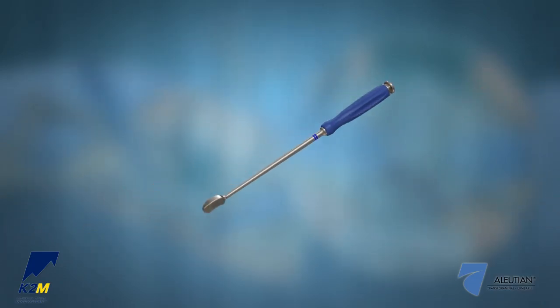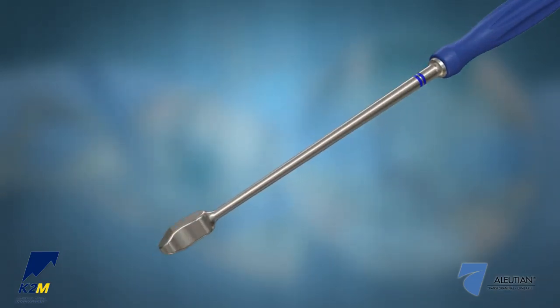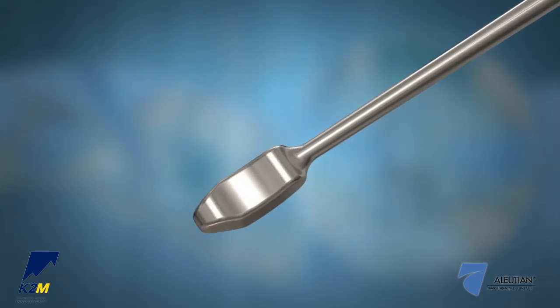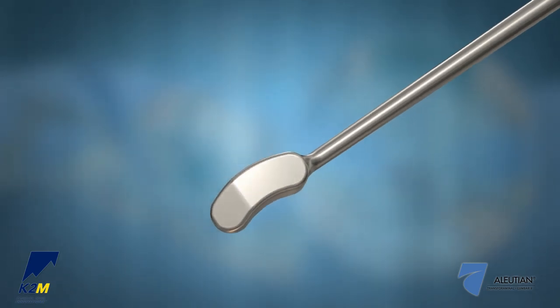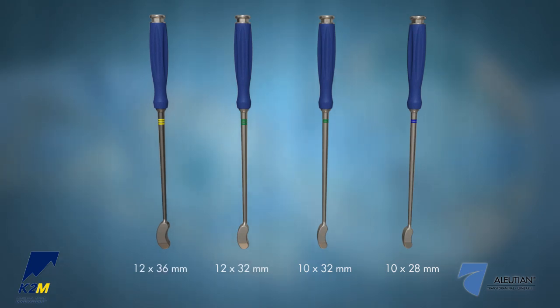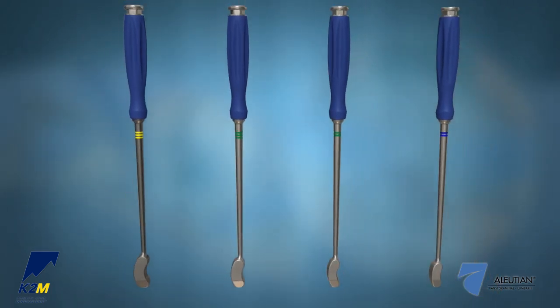Trials are available to determine the optimal size of the interbody. Trials have 7 degrees of lordosis and are undersized in height by 0.5 mm to allow for a slight press fit of the respective implant. If the trial appears to be too small, gradually increase the size until a secure fit is achieved. There are color-coded bands on the shafts of the trials to indicate the footprint of the corresponding implant.